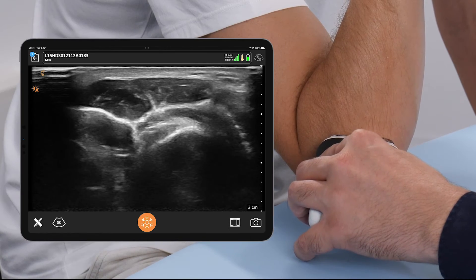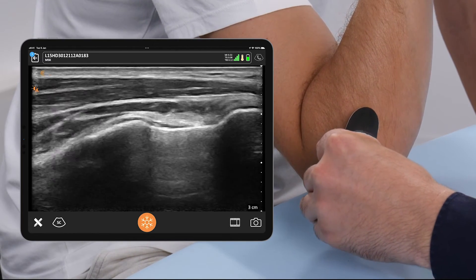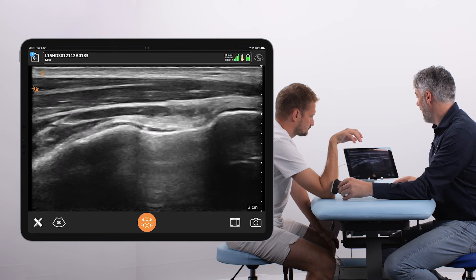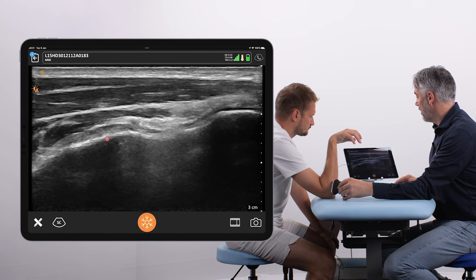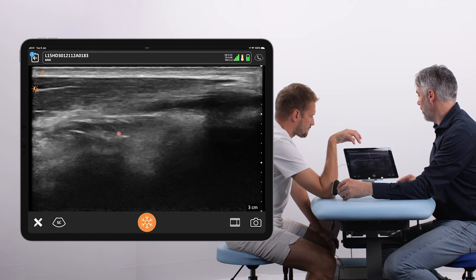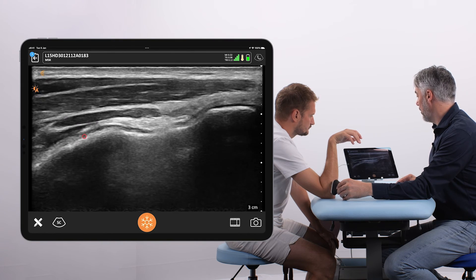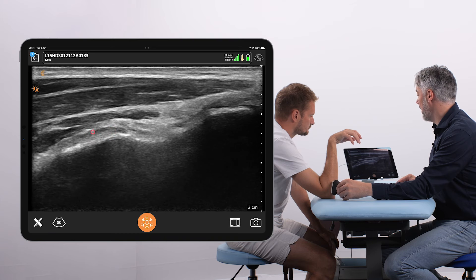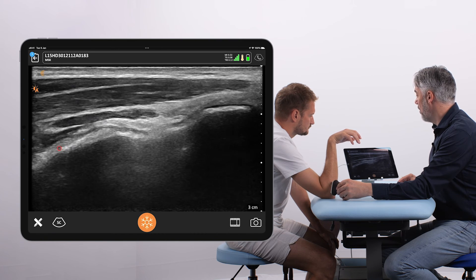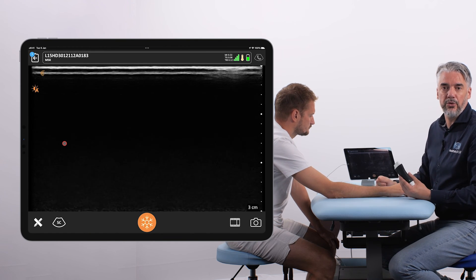Having checked this in the longitudinal position, we can turn the transducer to a transverse orientation. We can see that this is again the radial tuberosity. The previous view was longitudinal on the fibers; this is a transverse view on the fibers. At the level of the insertion, this transverse view shows the full insertion of the distal biceps — all transverse distal biceps fibers — and you can see how wide this insertion to the radial tuberosity is with this dorsal approach.